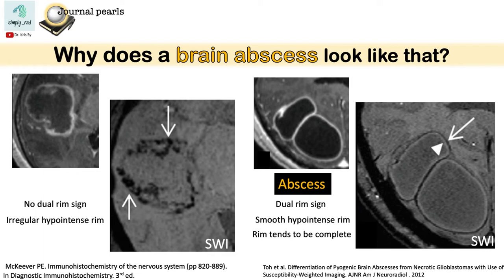This case on the left side of the screen is a necrotic glioblastoma. So why is the appearance very different? The difference lies in what causes the hypo-intense signal. For the abscess, the hypo-intense rim is due to the paramagnetic free radicals from the macrophages, while in glioblastoma, the hypo-intense rim is due to the blood products. That is why it has a very irregular appearance.